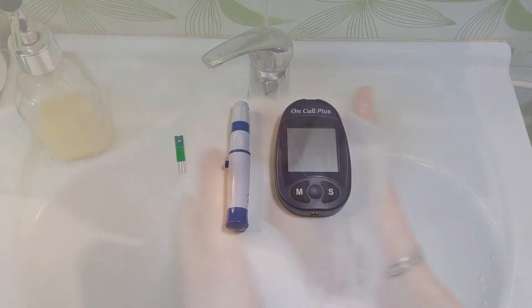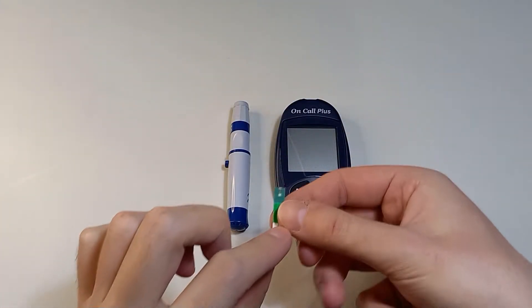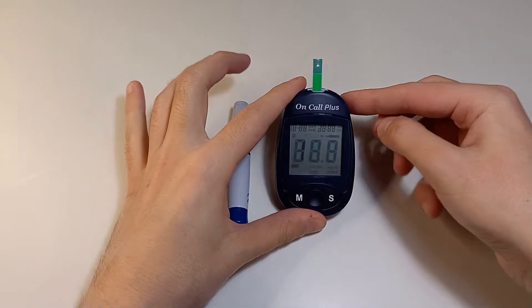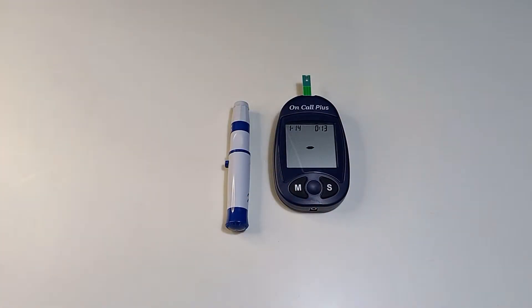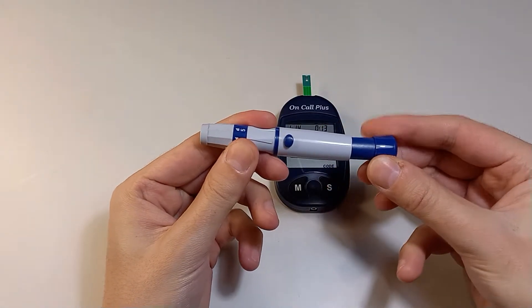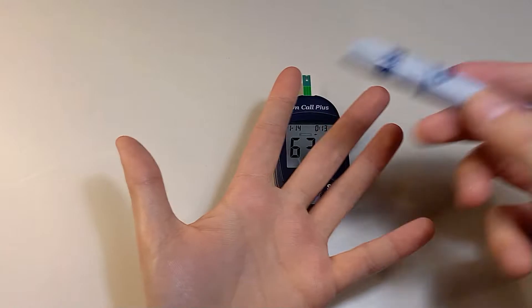You can use surgical spirit instead of washing your hands, but you have to wait for it to evaporate. Take the test strip and insert it into the slot of the device — now it is waiting for the blood drop.